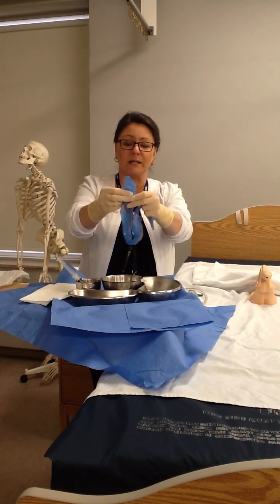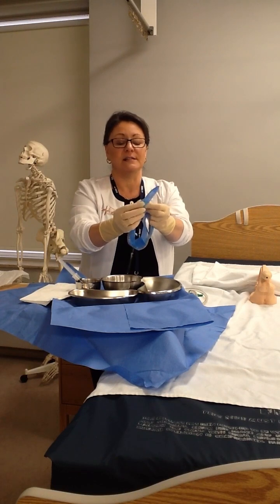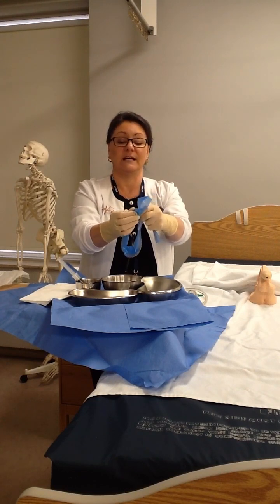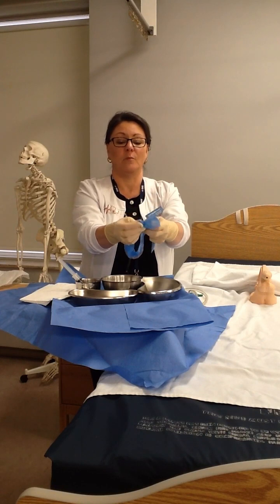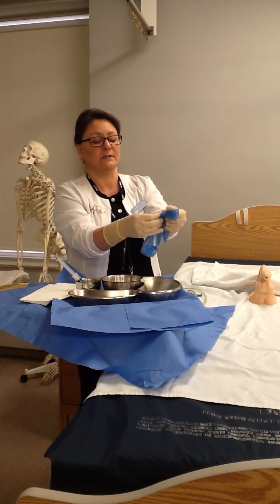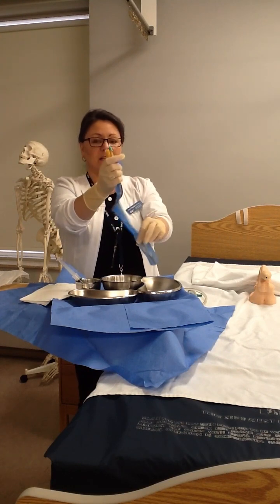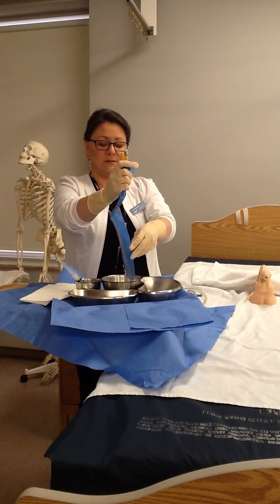Then I'm going to pick up my catheter, and it's quite springy. You have to be careful. There's a little perforated line you can see as you start to touch this package, and I'm going to just open that perforated line and expose those 2 lumens. Okay, so it's quite springy. You can see it wants to bounce all around the place.